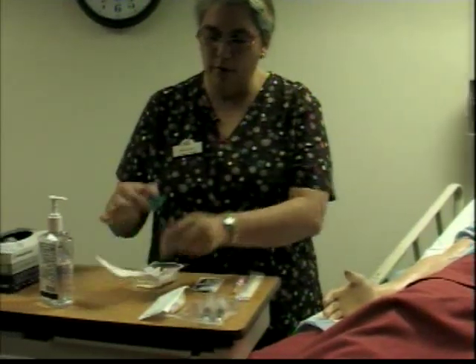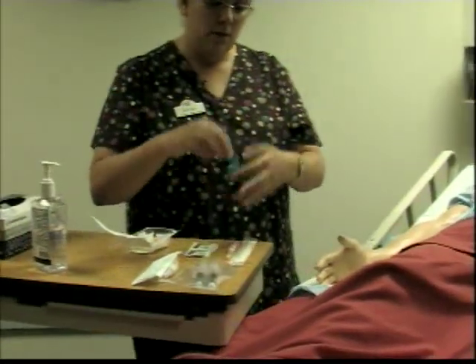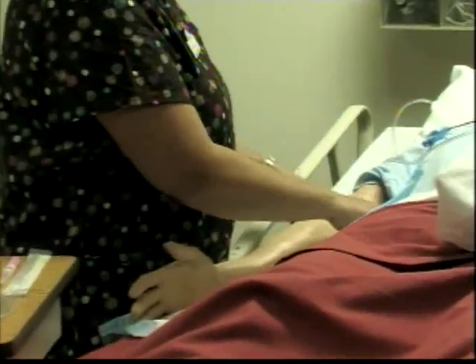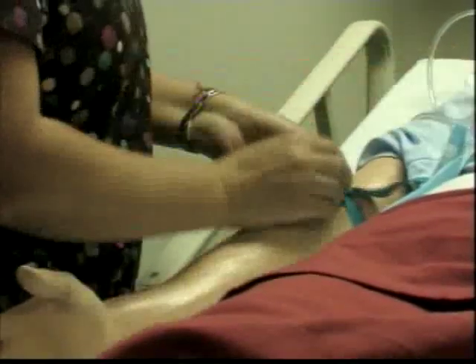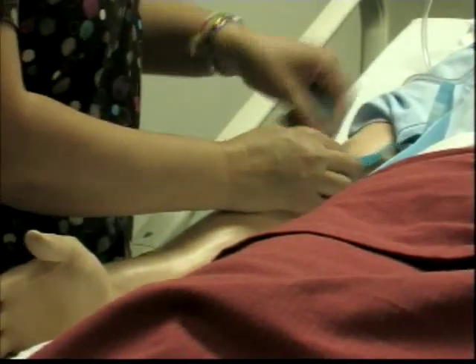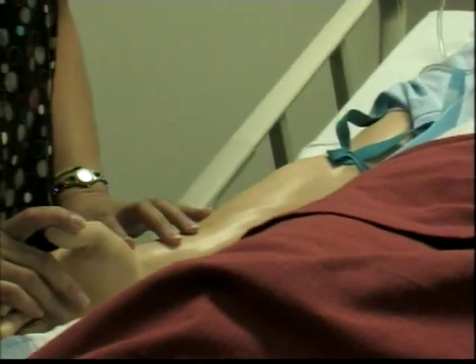So now I'm going to remove my tourniquet because I'm going to decide which vein I'm going to use. So you use your tourniquet, and you apply it about 4 or 5 inches above the site that you think you're going to puncture. You perform a loop, not too tight, because I've seen people just pull on this really tight, which will actually hurt the client. You want to make sure that it's snug, that you will have some type of pressure to allow the vein to fill.